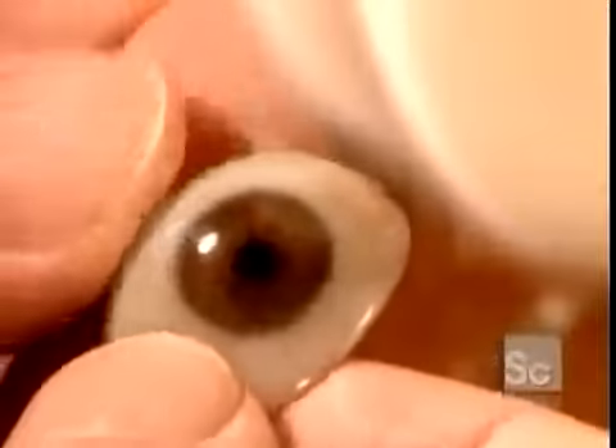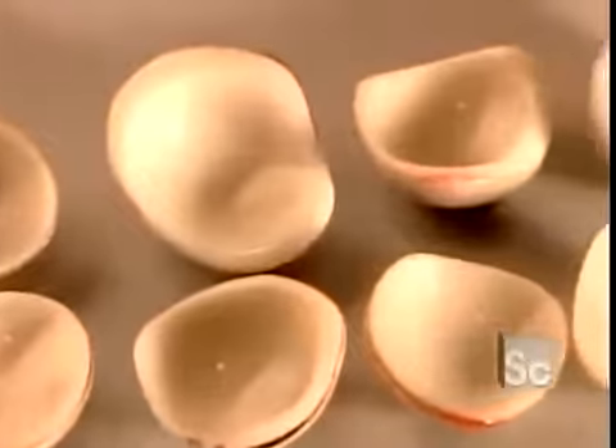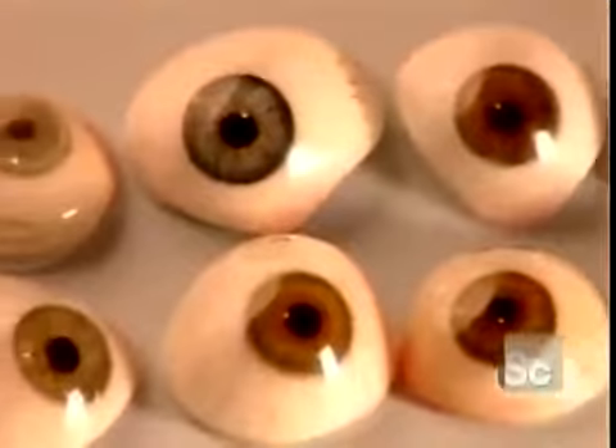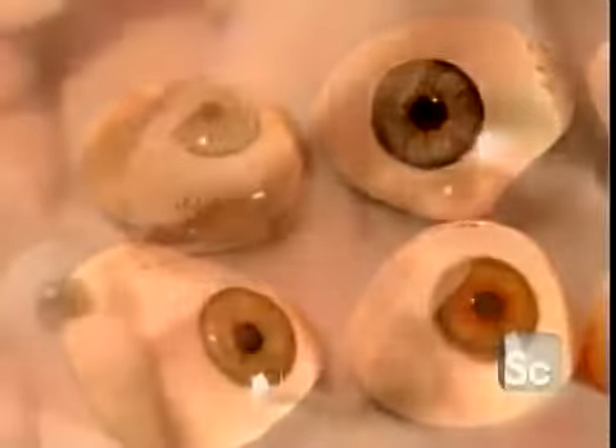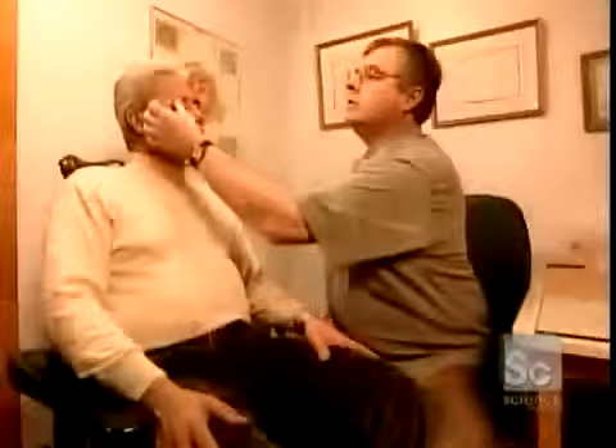Once that cures, they polish the eye to a shine with a cotton wheel. The shapes and colors of artificial eyes are endless, because patients' eye sockets and irises vary greatly, as do their sclerus — the white of the eye. This artificial eye, or ocular prosthesis, is ready.